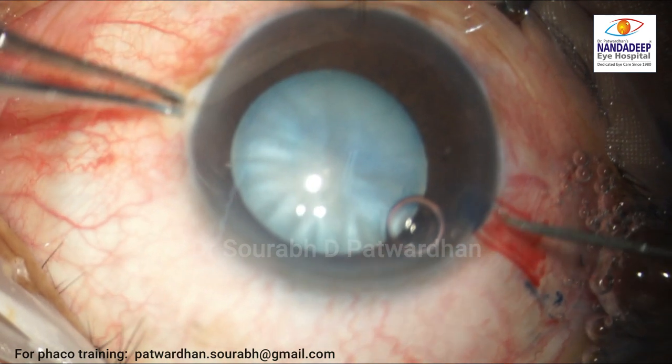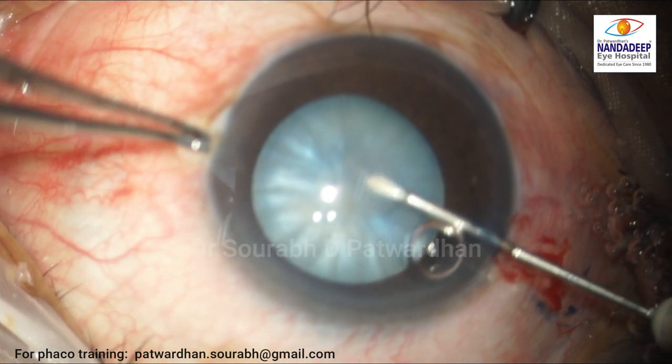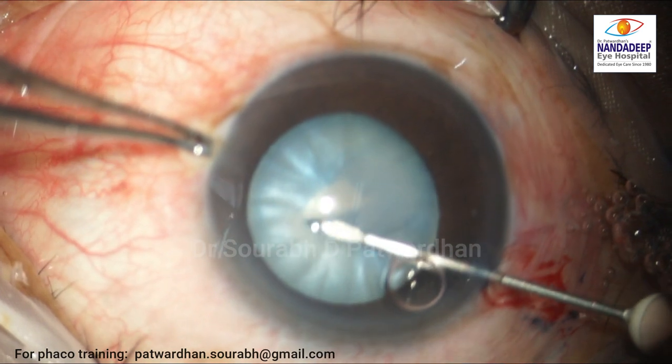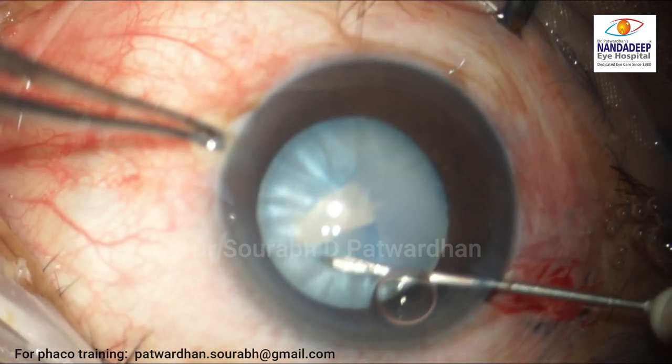The surgeon starts with a 26-gauge needle made into a cystitome. As the first puncture is made, you can see there is egress of white milky fluid from near the lens, indicating there is intumescence there.